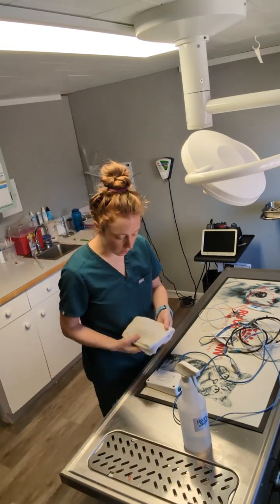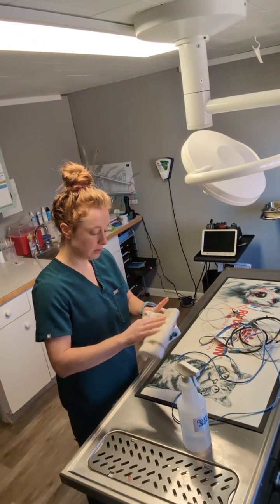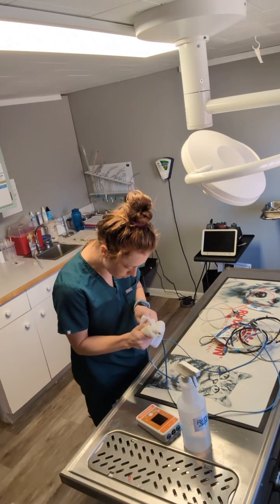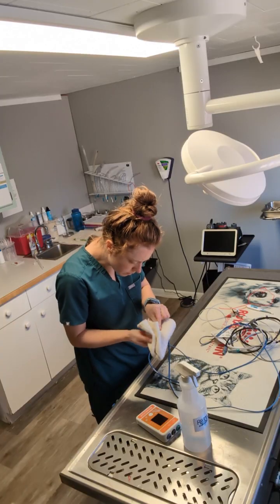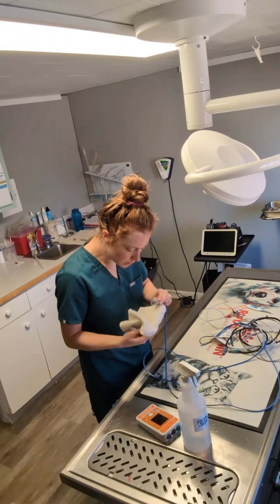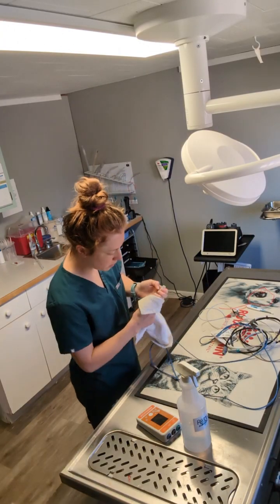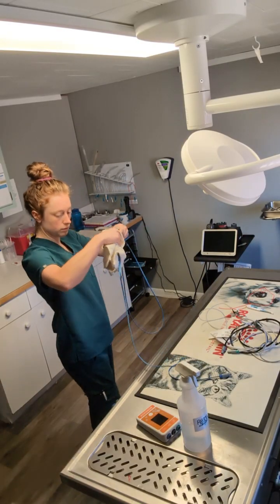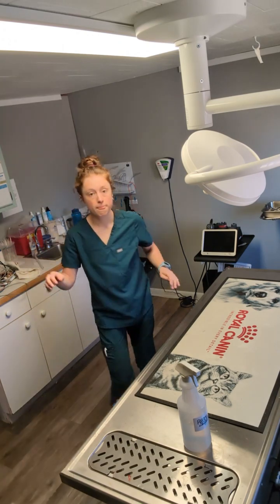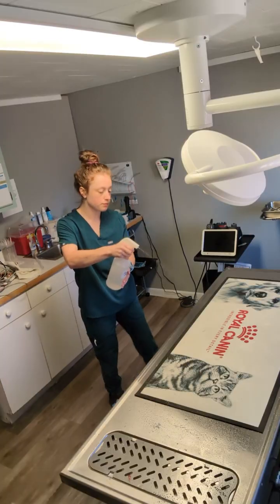So after 10 minutes, I can go ahead and wipe everything down. And finally, I want to spray the surface with the Rescue, and again, let it sit for 10 minutes.